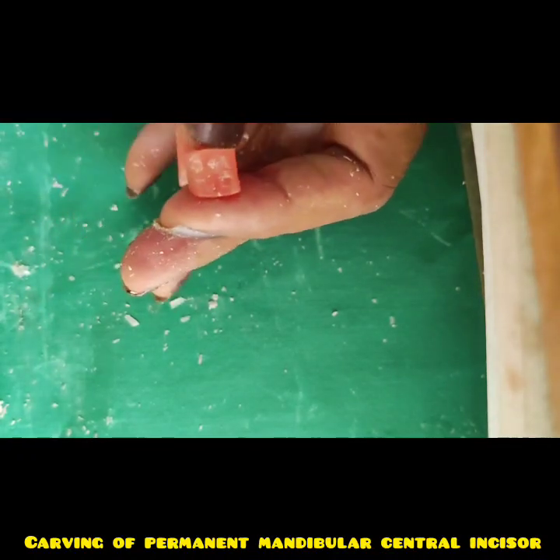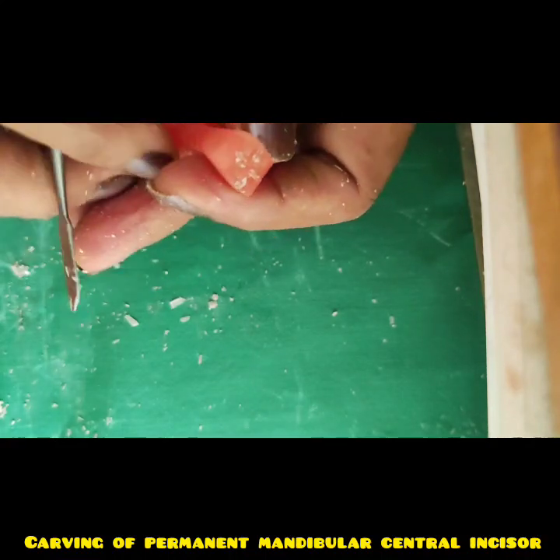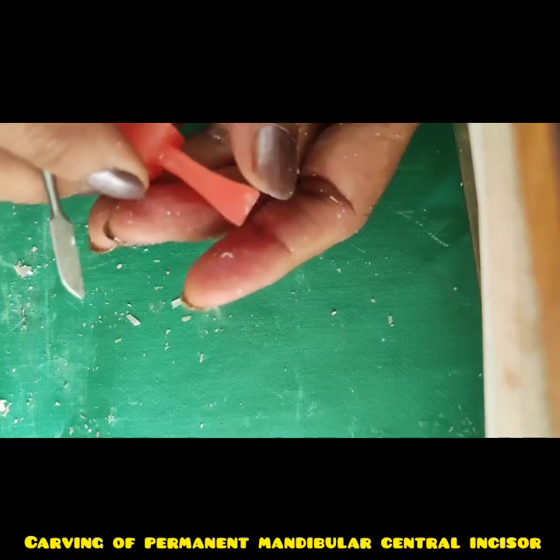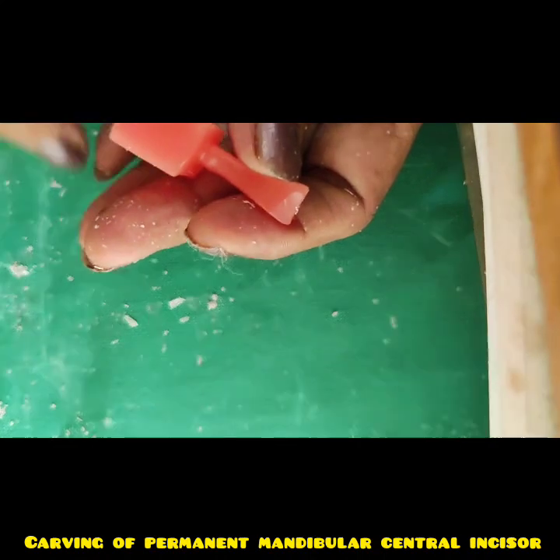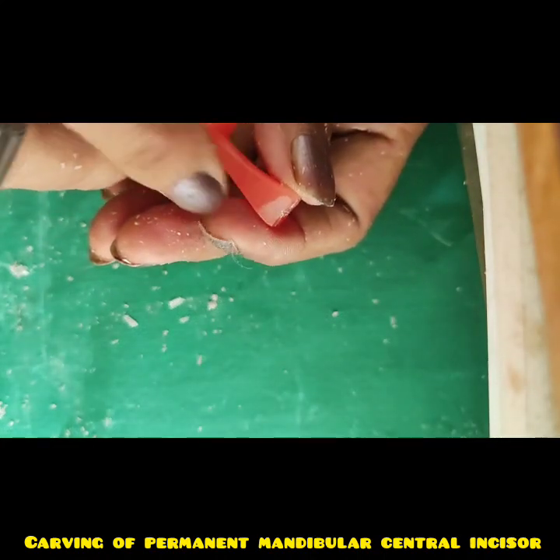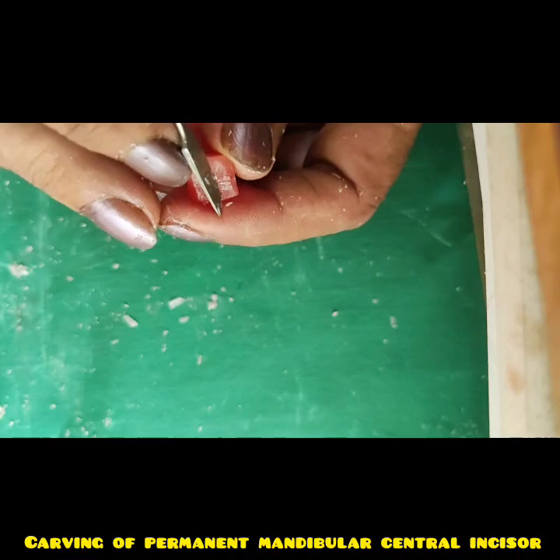So divide the block on top into a plus sign and select the dimension accordingly. The dimension I have reduced already. Now see, this is mesiodistally a little wider, so this is my labial surface, and this line will have the incisal edge.